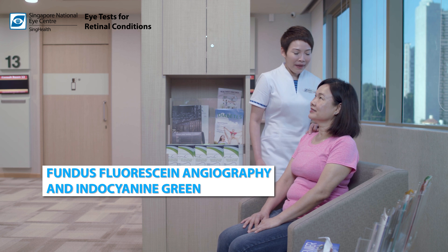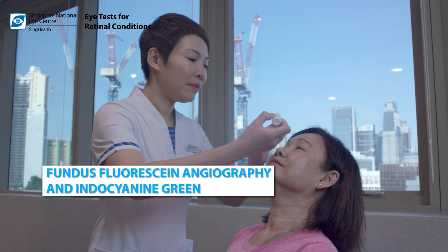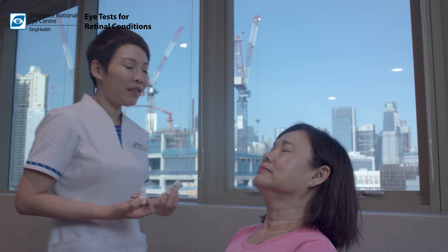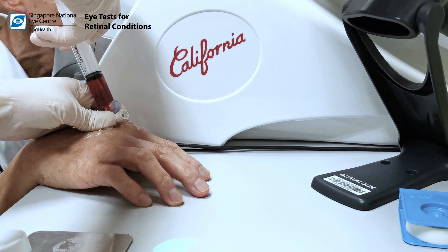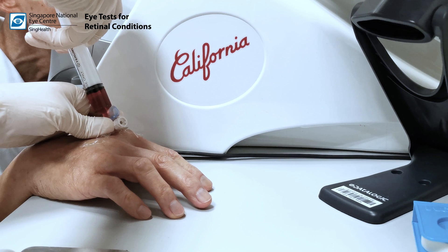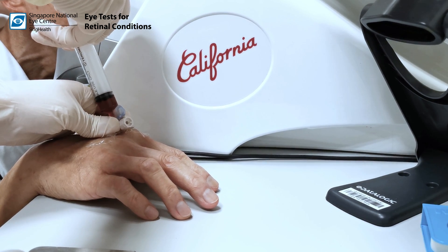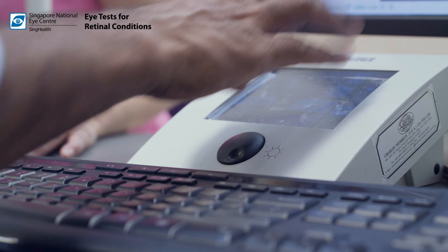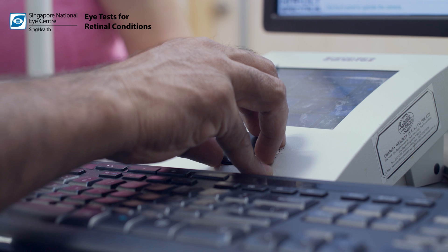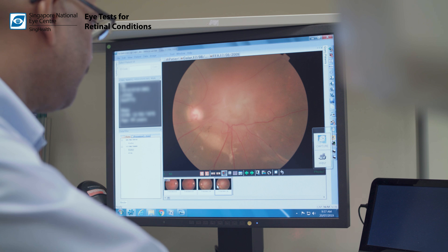FFA and ICG angiography are diagnostic tests to further evaluate retina and choroidal diseases. The patient's eyes will be dilated, followed by the injection of a yellow fluorescent dye and or indocyanine green into the patient's bloodstream through a vein in the hand or arm. A series of photographs of the eye are taken over the span of a few minutes as the dye enters the blood circulation in the retina and choroid in the eyes.